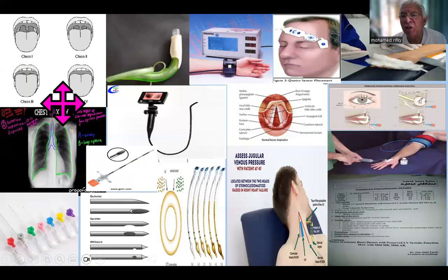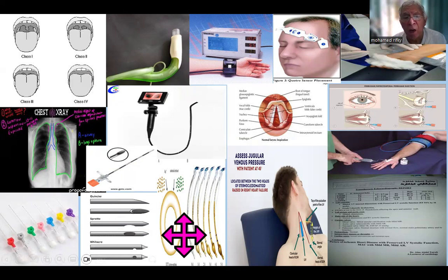These are some figures showing what's correlated to anesthesia. This is the Mallampati classification. Whenever I open the mouth of the patient by pulling the tongue, I can visualize the uvula and the position of the tonsils between the pillars. So this is a normal patient. And then we begin to find difficulty when reaching level four, which is a difficult situation, where we may fail to introduce the endotracheal tube. This is the internal diameter and this is the external diameter. So we may use a laryngeal mask.